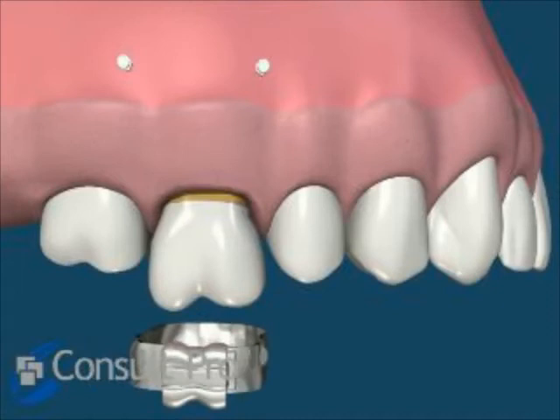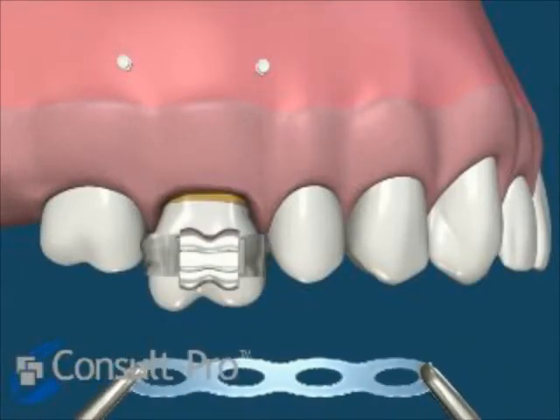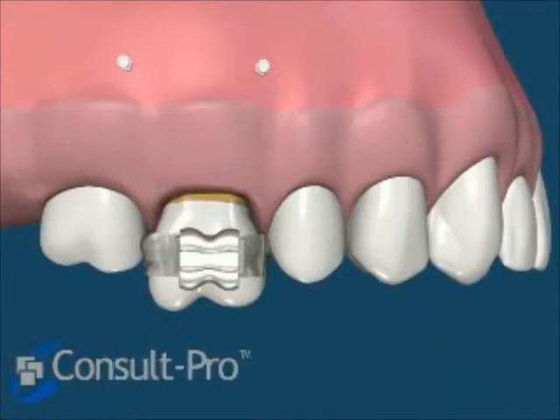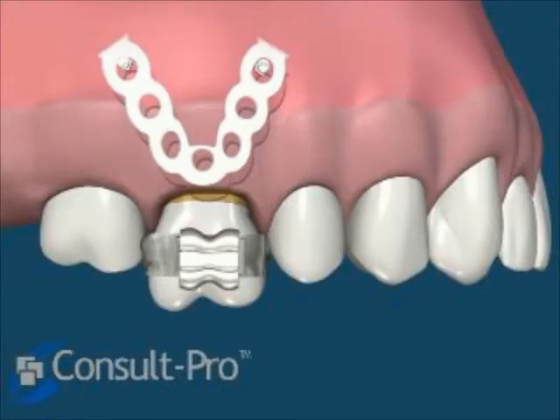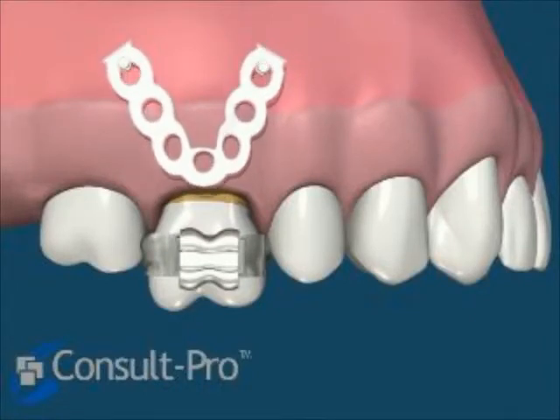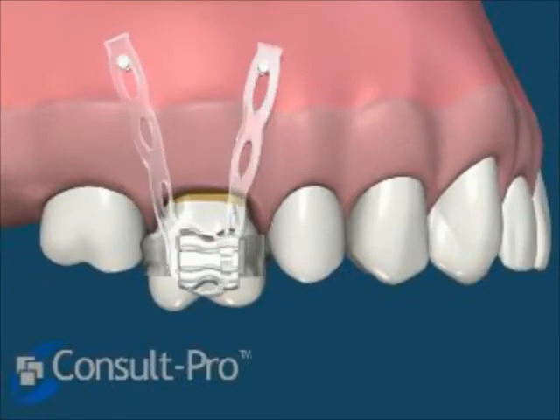You can see the screws would be placed approximately into the mucogingival junction up in the vestibule above the molar interproximally. And then we can place a band and utilize conventional orthodontic elastic forces — in this case just a simple power chain — to be applied to a cemented band onto the molar.